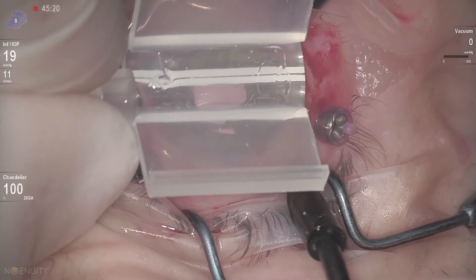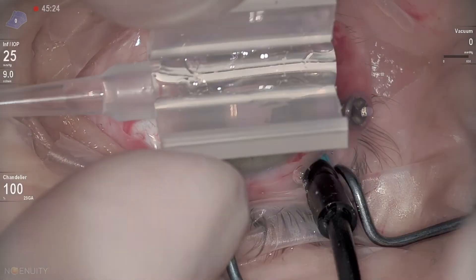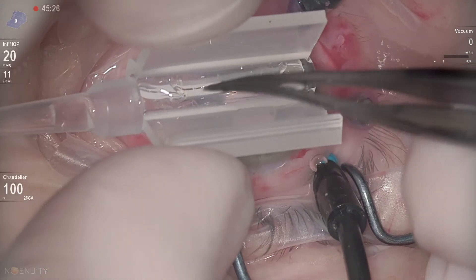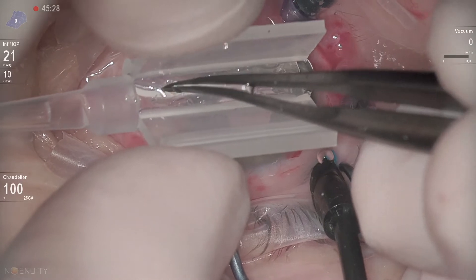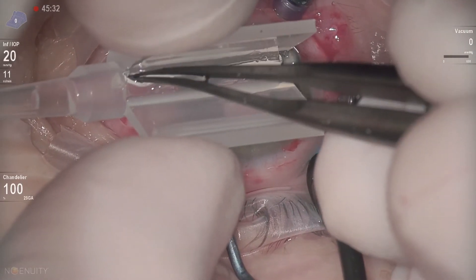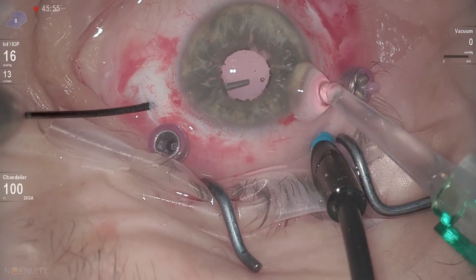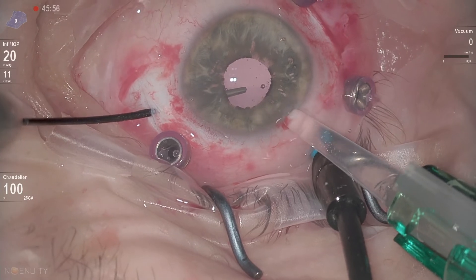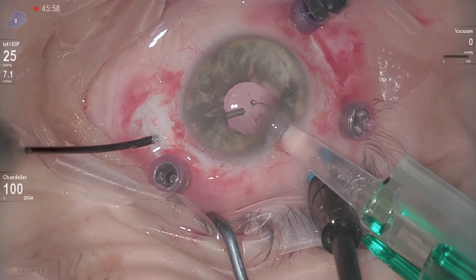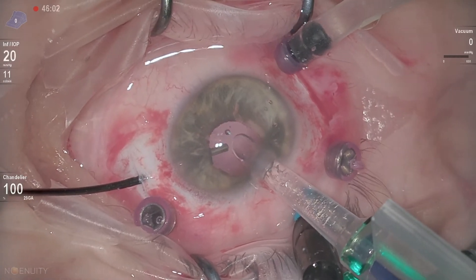Now something really important: all the damage with the Carlevale might happen in the cartridge. I try to pay close attention when loading it, especially the anchors. But here something happens with the posterior anchor. During the implantation I try to engage the leading anchor with the forceps.